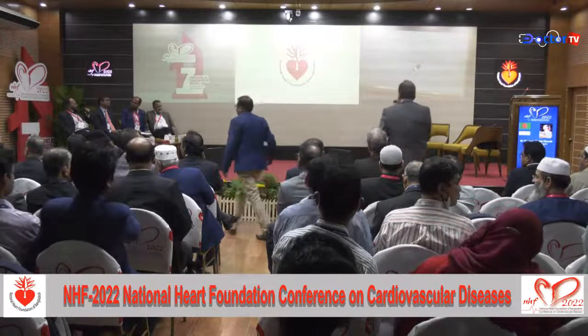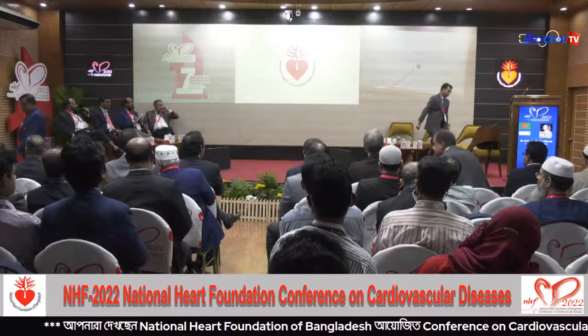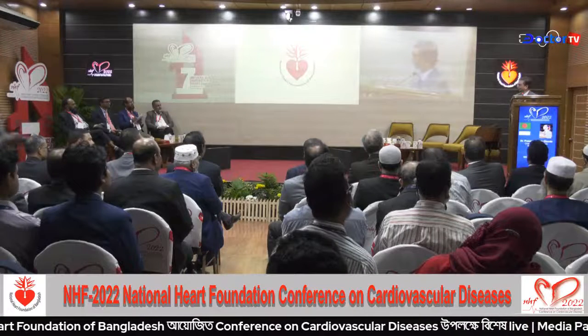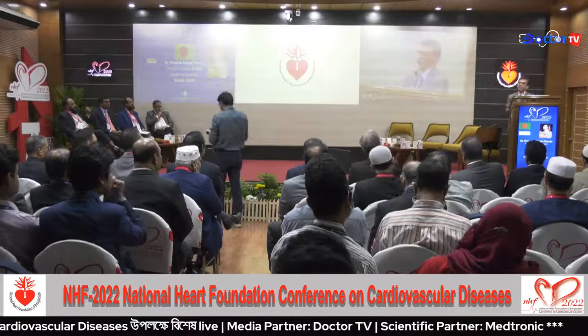What is your conversion rate in off-pump to sternotomy? The question is very relevant. We are actually ready to convert to CPB, not to sternotomy, because through the thoracotomy, if we go to conversion to sternotomy and CPB, it is really difficult.